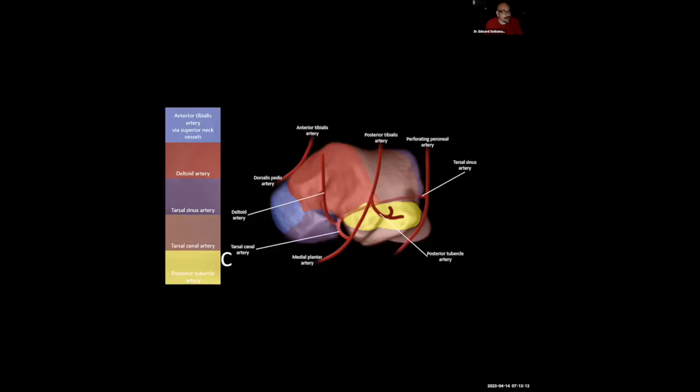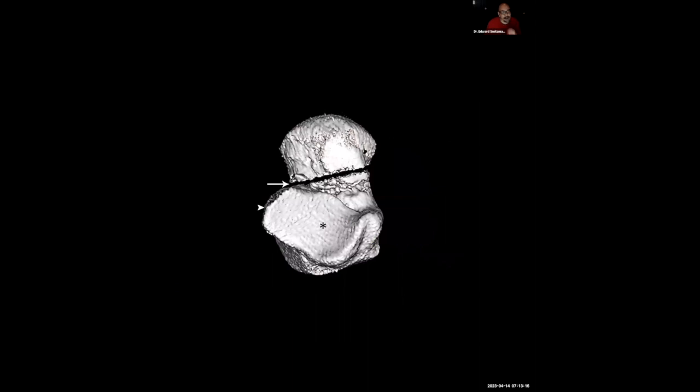So why is this all important? Because talar fractures account again for about 5% of ankle fractures and about 1 to 2% of all fractures, and as I mentioned, result from high energy traumas and are usually a constituent of polytraumas. So initial imaging of these hindfoot fractures obviously is going to involve radiographs. But unfortunately, a lot of these talar fractures can be missed, depending on who you read, 25, even up to 40% of the time. And moreover, trauma patients are going to present in extremis.